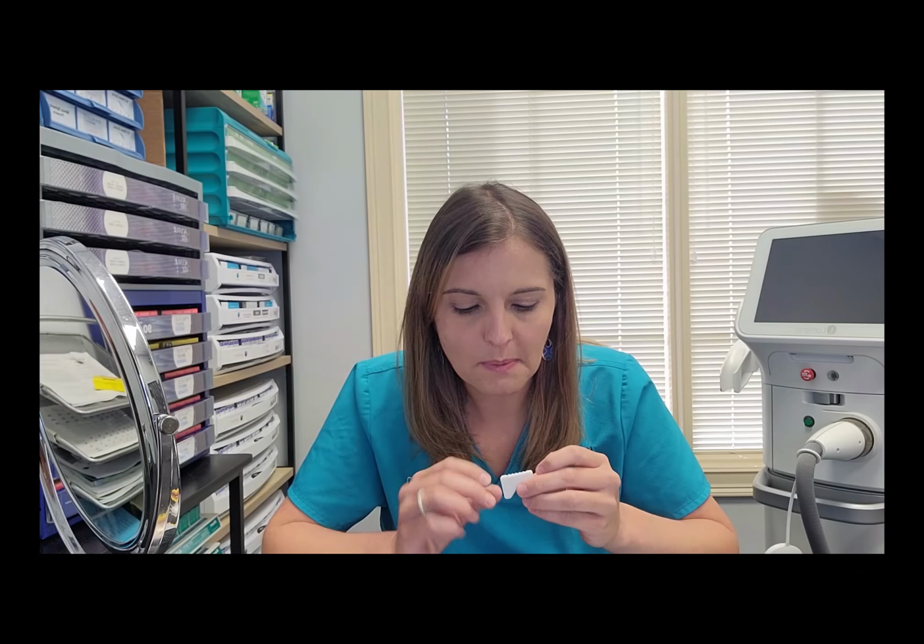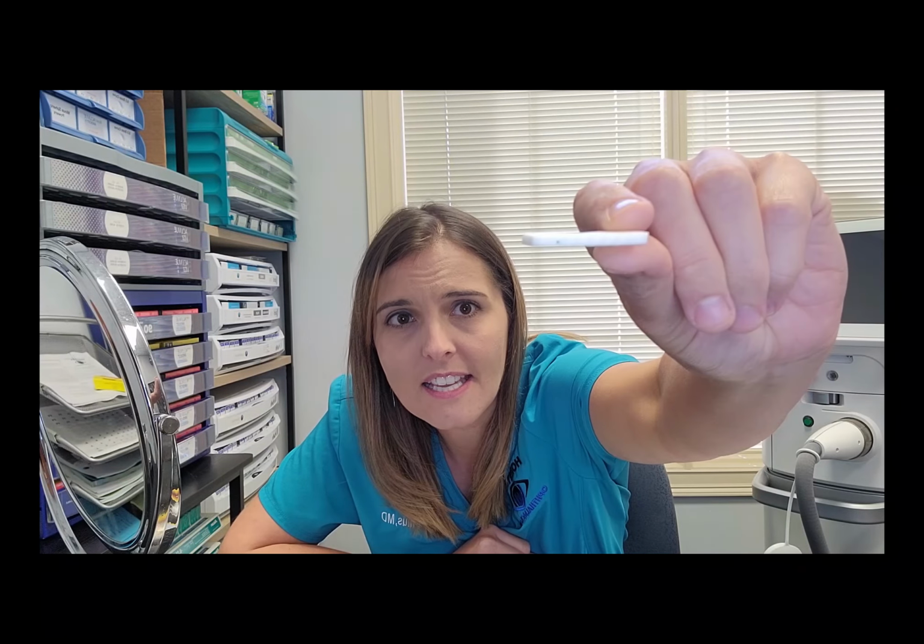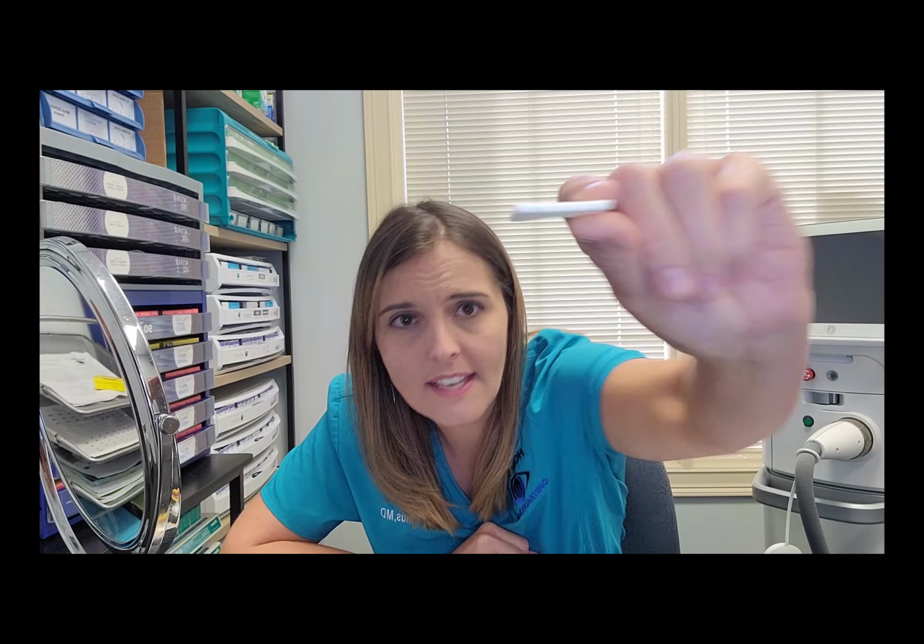You probably can't even see this, but this is one of the temporary plugs. If you can even see that tiny blue dot in the middle of that white, that's how tiny this is. And this is a 3-month plug. It'll last for about 3 months. There are ones that last about a week or so. I think 3 months is a great way to know if it's going to work. That way, if it helps and around 3 months later you start getting worse, okay, yeah, we know it worked and let's put a permanent one in.